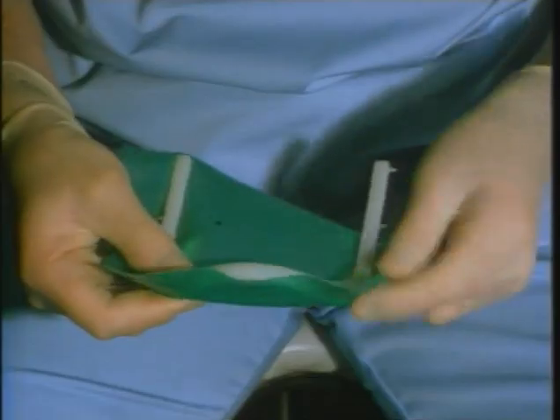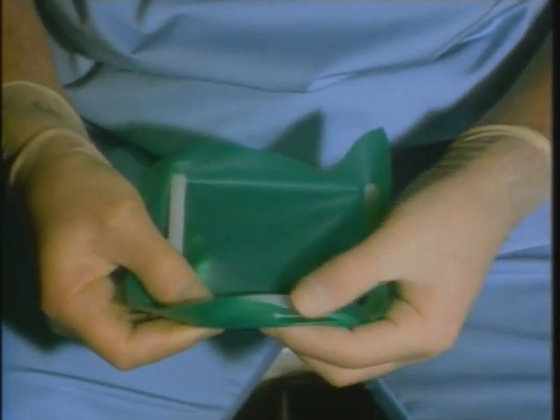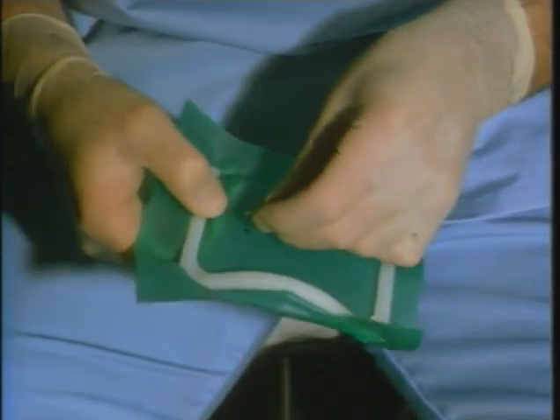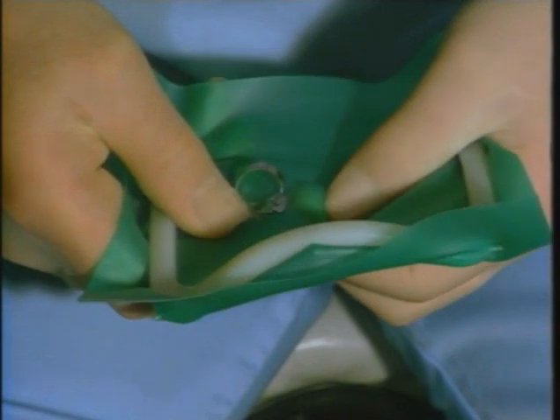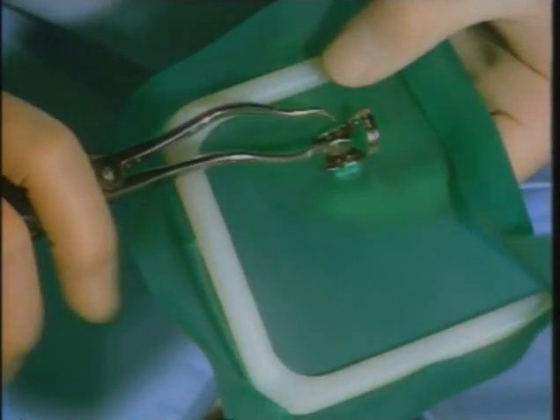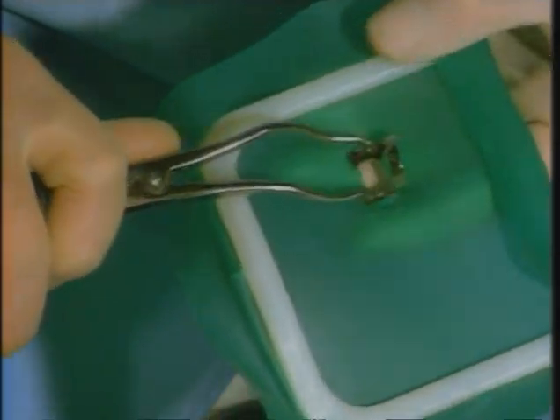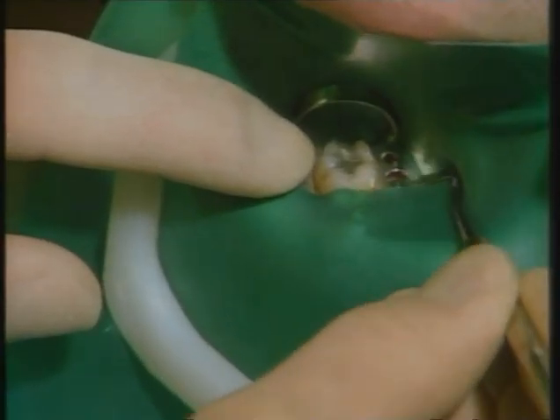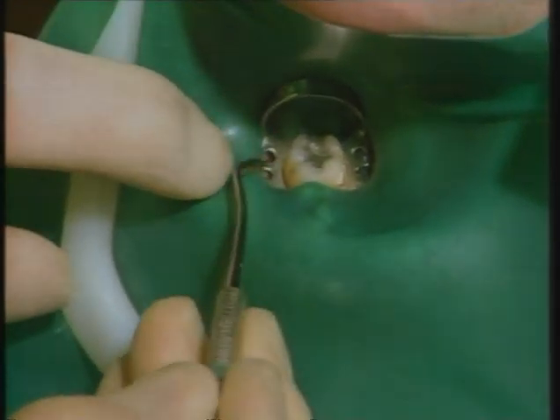Now there's one other thing, single tooth isolation, as for example when a tooth only requires an occlusal opening for endodontic treatment. So the rubber's being put on the frame here and stretched so that it's just nicely held in place, and the clamp can then be fixed via its wings through the hole in the rubber, and so that the three are all joined together. And then by picking up the clamp with the clamp forceps, then the whole combination can be taken straight to the mouth, and the clamp will just fix it all to the tooth. And very rapidly, the dentist will be in a position to proceed with his restorative procedure. And it's very easy for the patient at the same time. So he's now ready to go.